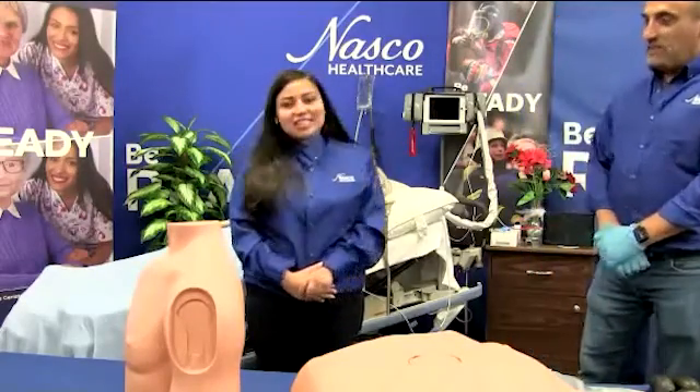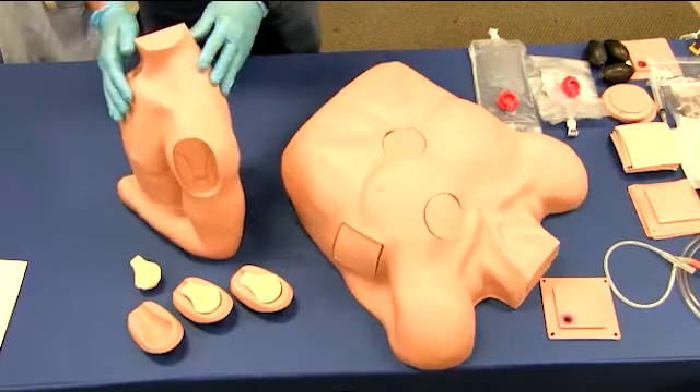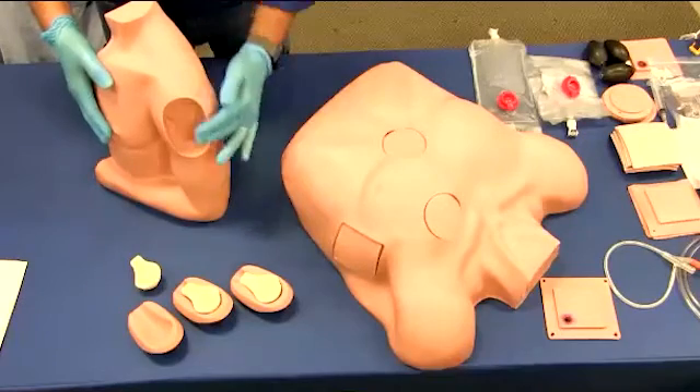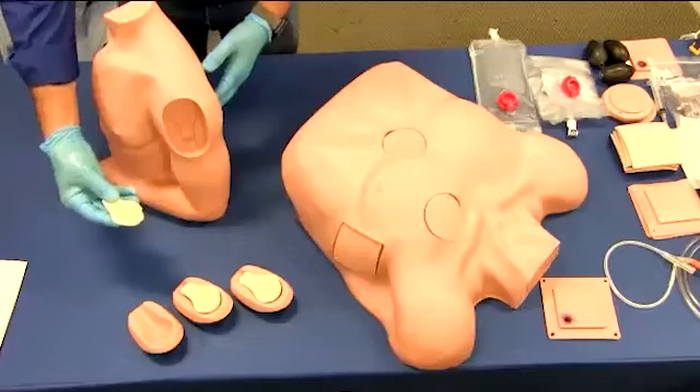We are ready. Excellent. Let's begin. We will begin this session with our humerus intraosseous trainer. The NASCO healthcare humerus IO trainer is perfect for training the access procedure for fluid management through the humerus bone.